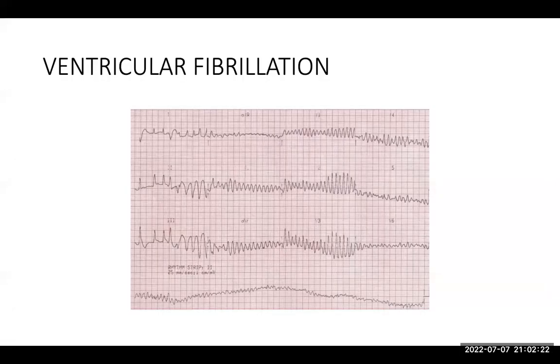Yeah. So the other question, Doc, is someone asking how you differentiate between the U wave and the Mobitz type 2. Those ones don't have a relationship at all. I know what the person is asking: does the U wave look like a P wave?